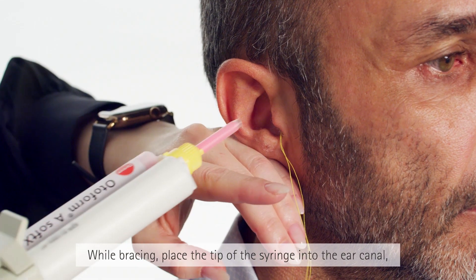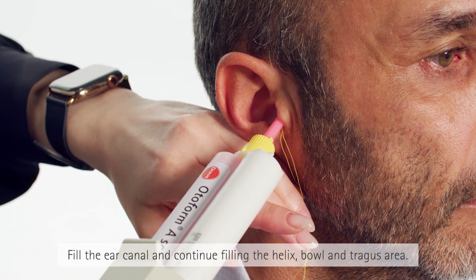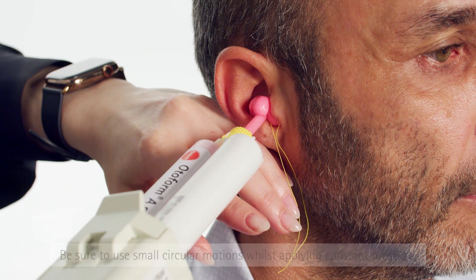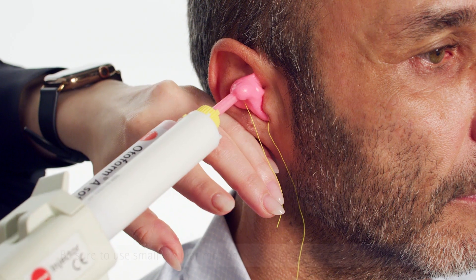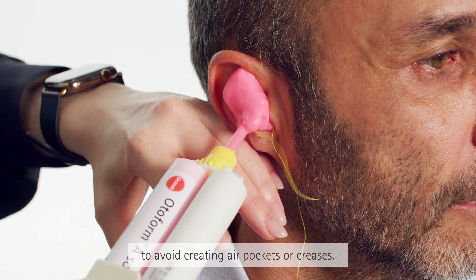While bracing, place the tip of the syringe into the ear canal as close to the Otoblock as possible. Fill the ear canal and continue filling the helix bowl and tragus area. Be sure to always use small circular motions whilst applying constant pressure, and always keep the end of the nozzle in the material to avoid creating air pockets or creases.